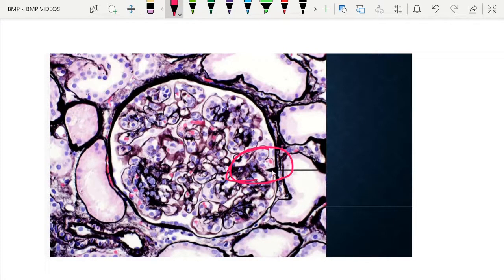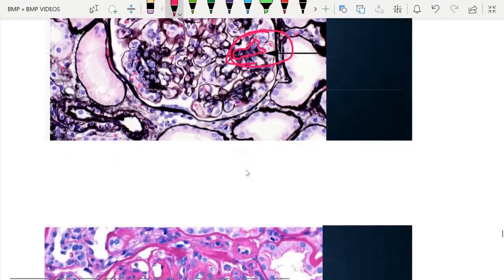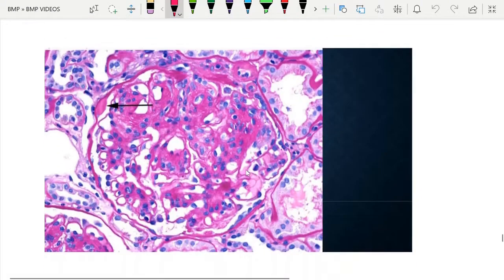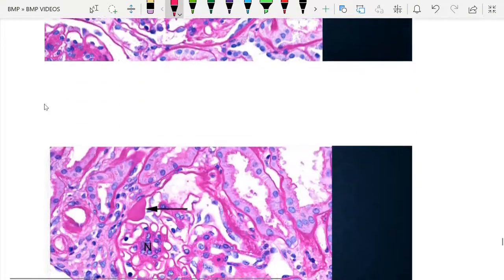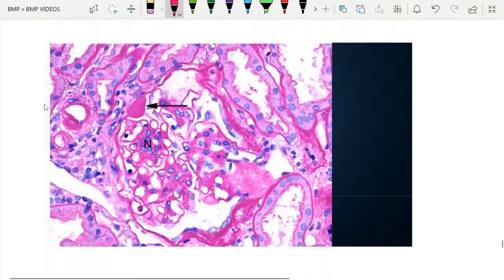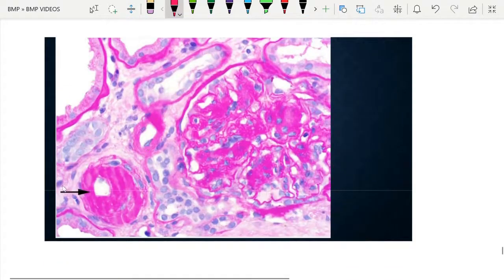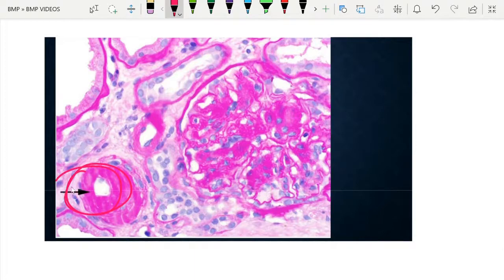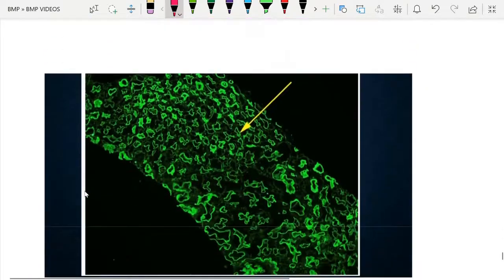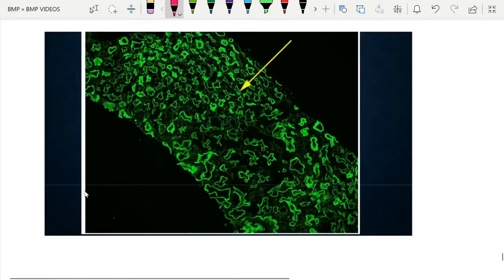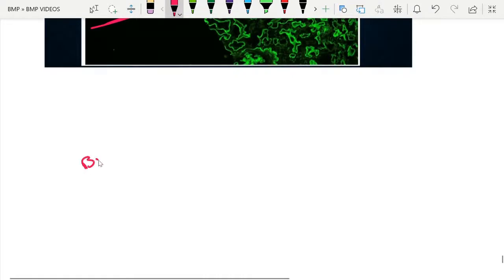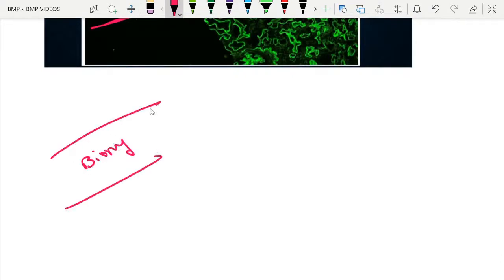Another image shows capsular drop, and another shows a capsular drop alongside a nodule with mesangial hypercellularity. Arterial hyalinosis along with mesangial expansion is also shown. Tubular basement membrane with non-specific IgG trapping is demonstrated. These are all the biopsy findings in diabetic kidney disease.